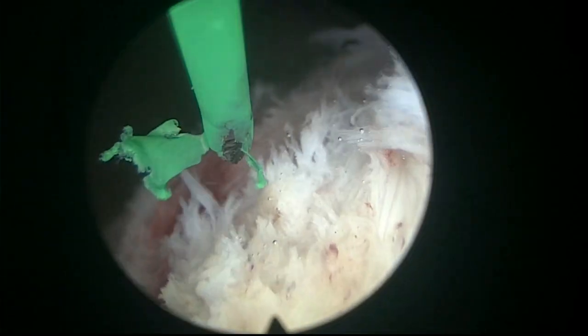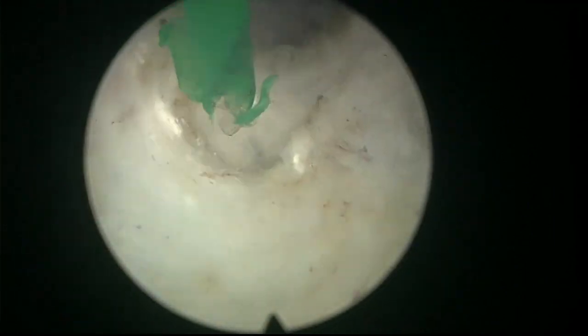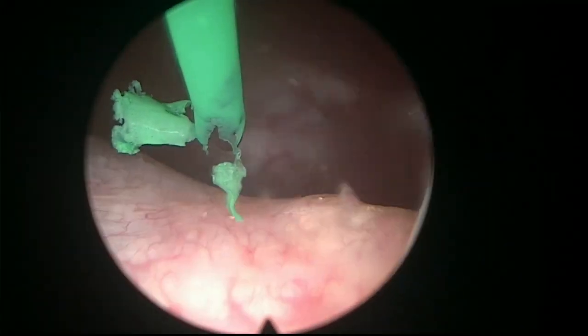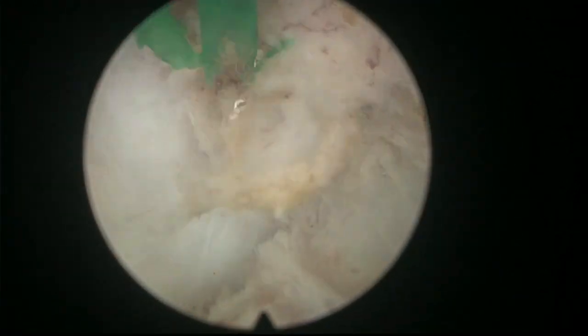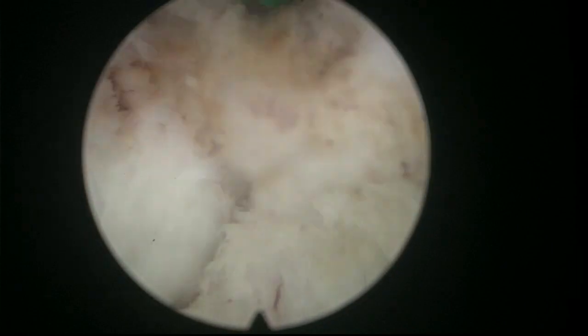This is the other side of the bladder neck. This is middle lobe tissue. I'm making the cut of the bladder neck, trying to follow the, let's say, circumference of the bladder neck. And here again, we have to be careful because the UO is likely to be very close as well. We have passed the UO medially. So I'm quite sure now that we won't damage it by following this dissection, let's say, route.